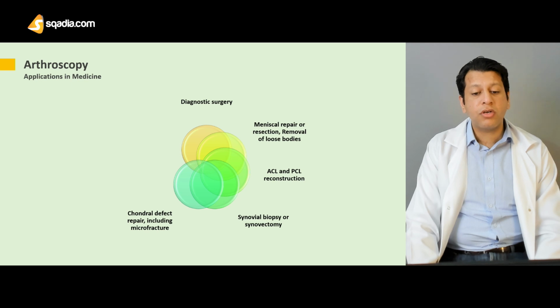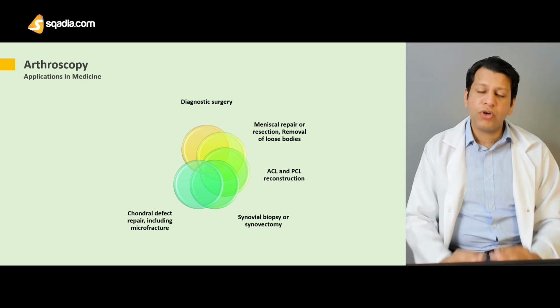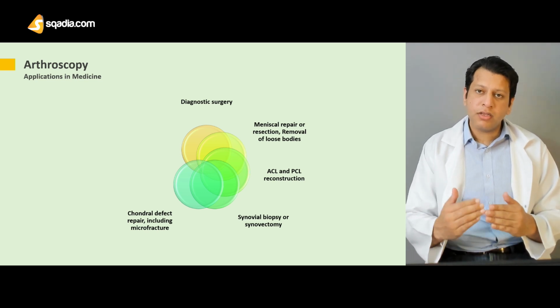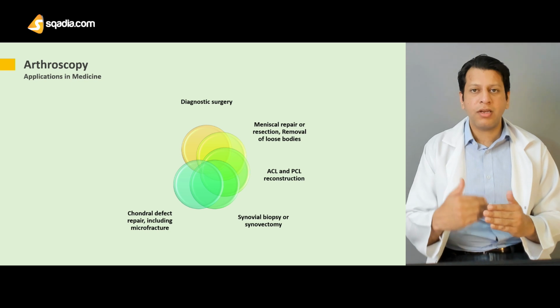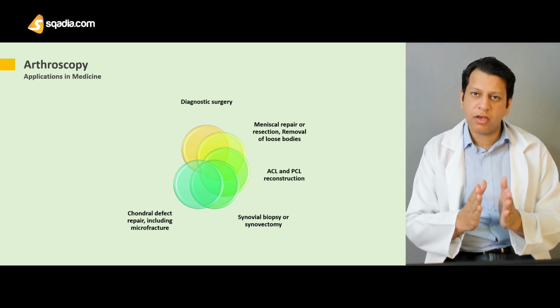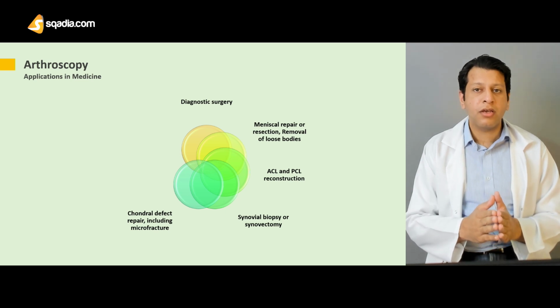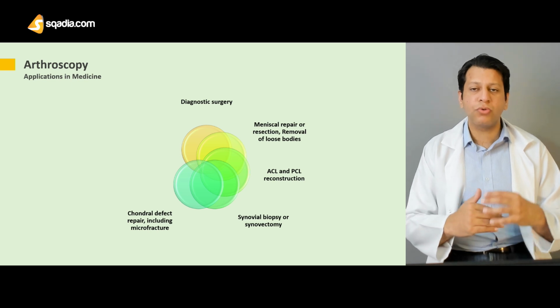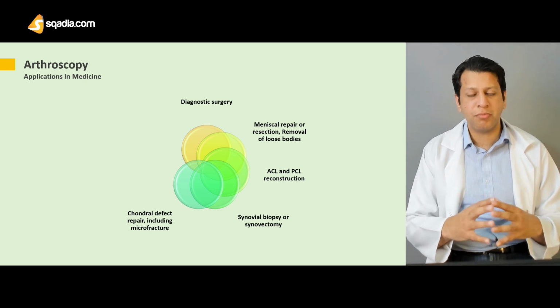Then if there is a chondral defect, there's the microfracture technique for treatment of chondral defects. If for example at any area of the femoral condyle there is some loss of cartilage, that is actually problematic because that will be very painful, and then subchondral bone will be exposed, and that will create more problems for the patient.